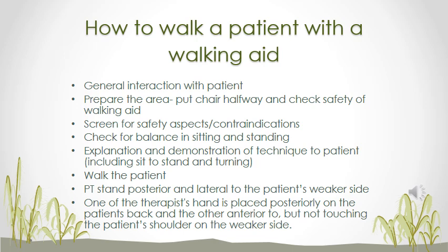General interaction with your patient, very important. Prepare the area. How do you do that? You put a chair halfway the distance that you have decided to walk. Let's say it's to the door of the room or the cubicle. Then you will put a chair halfway, to make sure that if they want to take a rest, you don't have to leave their side, but you can simply say, let's just walk to that chair. That's our first goalpost.